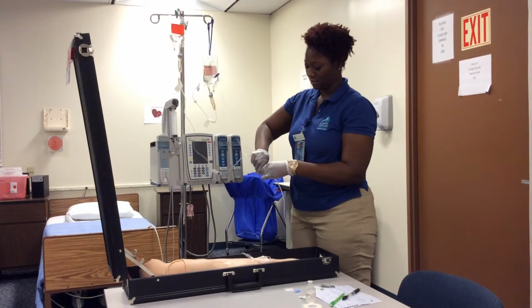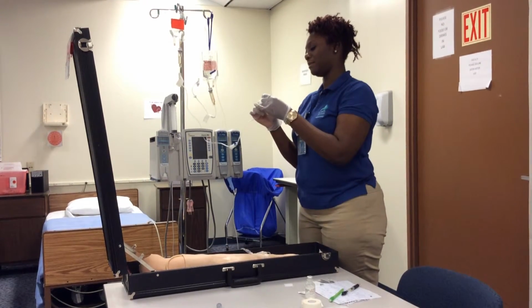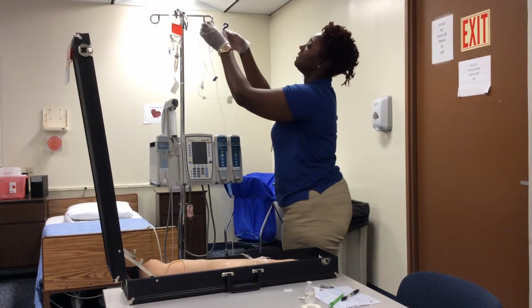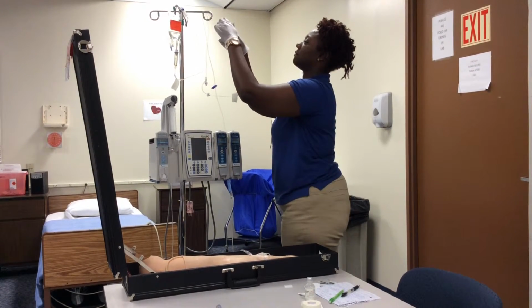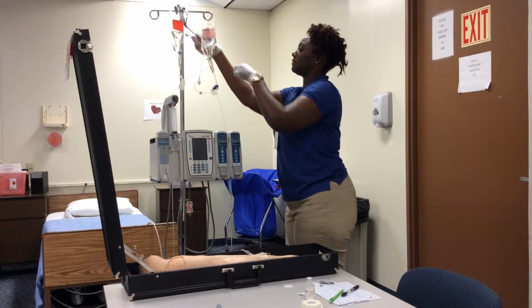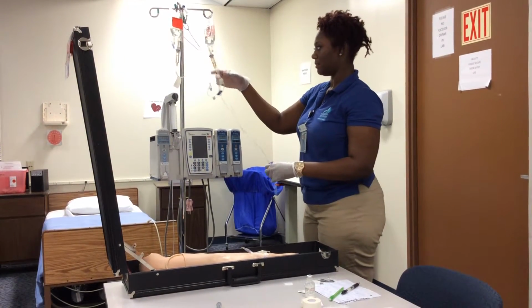Remove. Place my alligator clamp for next administration. Bring up the primary line and establish the rate per doctor's order.